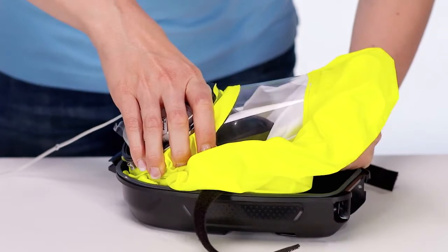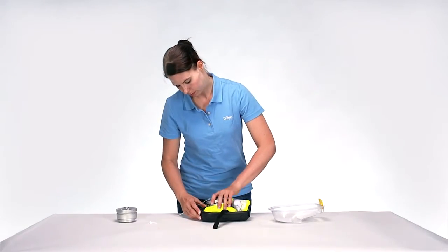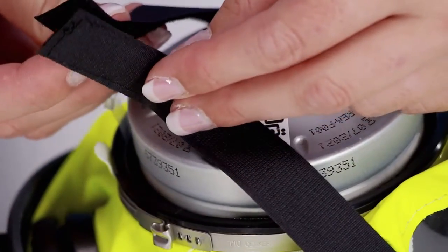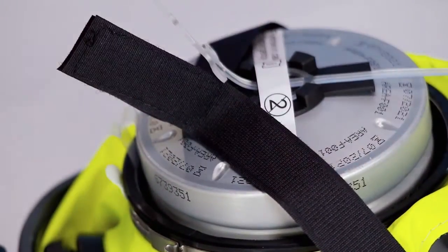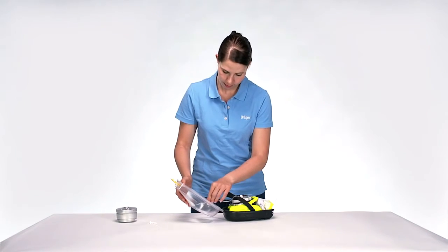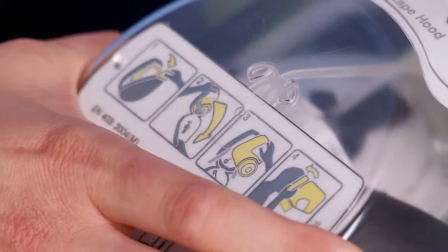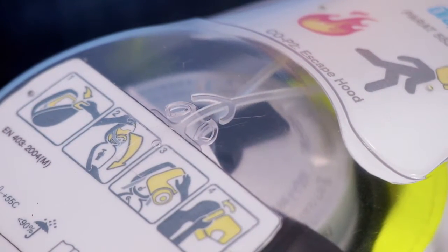Caution! The filter sealing plug must not be removed during this process. Press the filter into the half mask and close the holder under the front filter sealing plug using the Velcro fastener. Make sure that the straps of the Velcro fastener are mounted in the same direction. Next, thread the second pull string from the front of the filter into the upper lid of the hard case. Pull the pull string until it clicks into position. You can visually check through the transparent cover whether the pull string is in position.